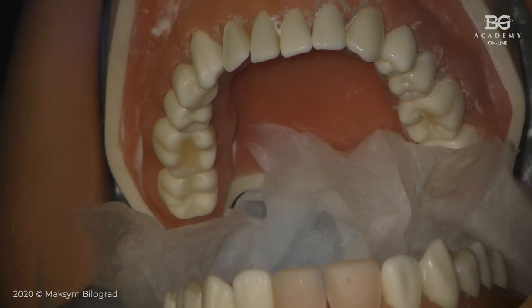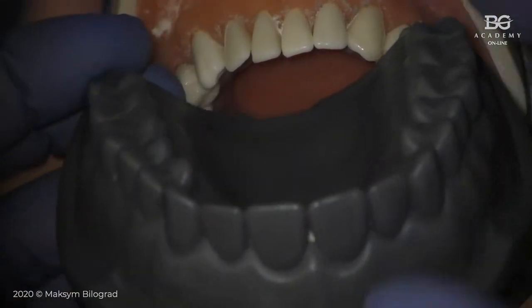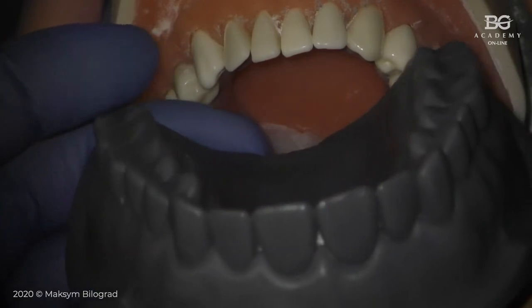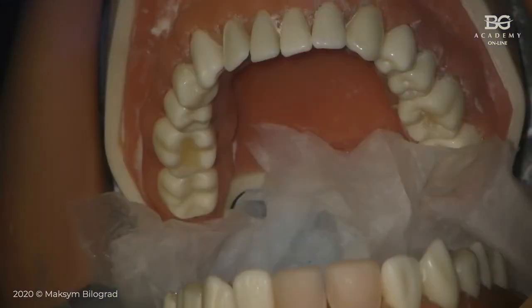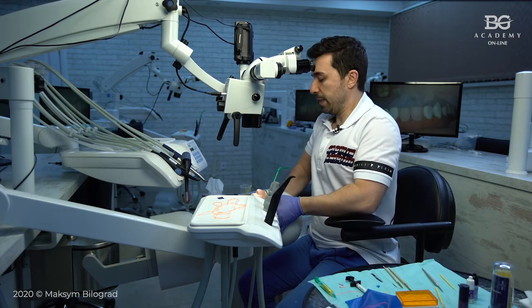Or there is a good thing, once you have a model, okay, here from the microscope, this is the model where veneers were made. So what you can do, you just put rubber dam over this model, you make some light stretching, okay, just light stretching here, and then your assistant will mark these tips of teeth, and then you perforate, and you will have a customized rubber dam for the process of treatment, and that will be a really nice and efficient way to get your rubber dam inverted in between teeth. So perfect.